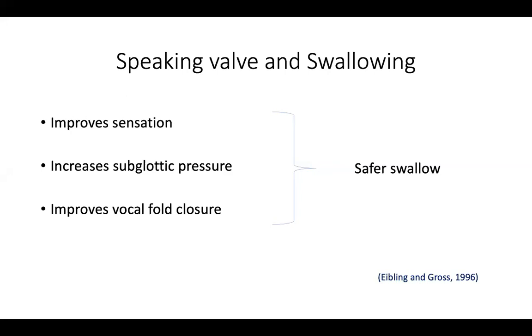So keep in mind, if you assess this patient for swallowing without putting a speaking valve on, and he has been trached for a very, very long time, no airway circulation, muscle weakness, atrophy, patient is weak, reduced endurance, then most probably he will fail the swallow assessment. But if you put the speaking valve on and you restore the upper airway mechanism, it's like you're rehabilitating that patient's swallow in a way, and it will improve the chances of having a better or a safer swallow.